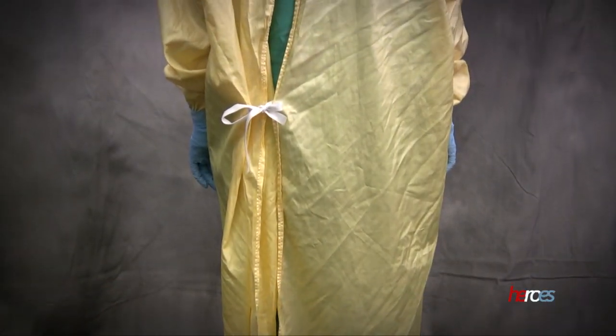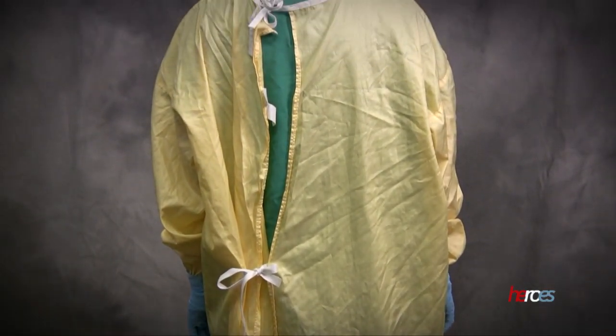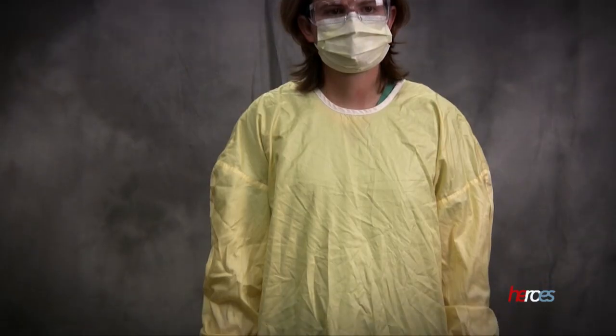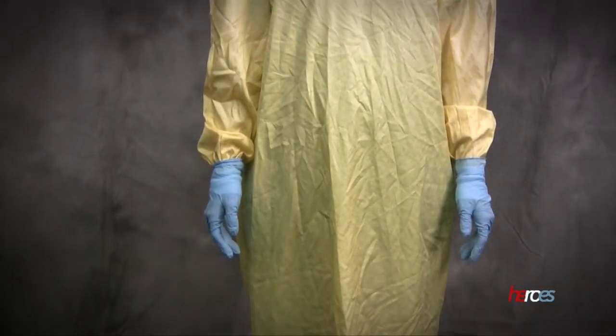Before entering the room, ensure all personal protective equipment is in place and comfortable. This will prevent you from adjusting your personal protective equipment while in the patient care area and potentially contaminating unprotected areas of your body. You are now ready to provide care to your patient.